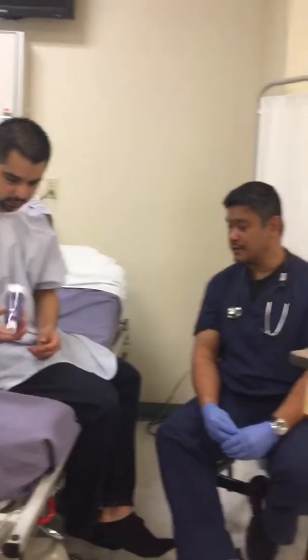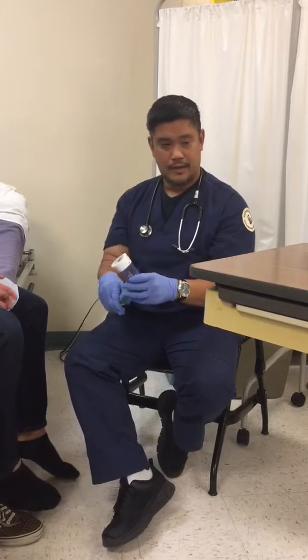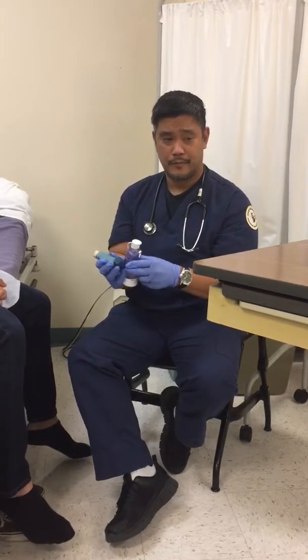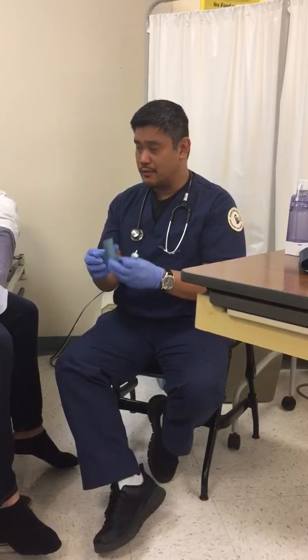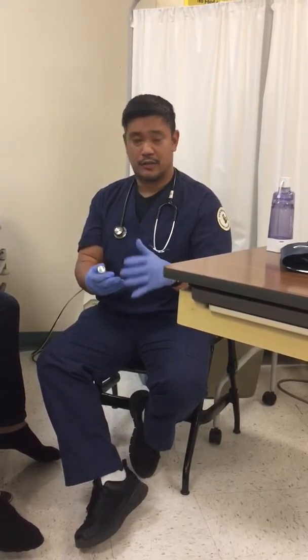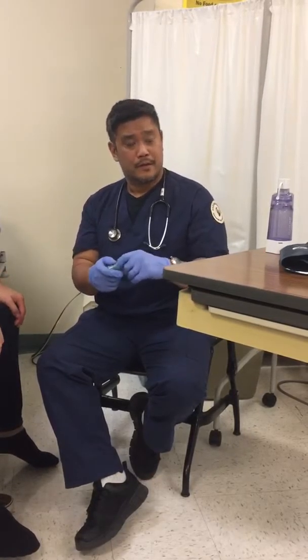And you will be taking this home with you when you get discharged. We'll be holding on to the medication until then. For cleaning purposes, if you do need to clean it, you just use some tap water, no soap or anything like that. So just remove the canister, run it under some water, and you're going to air dry this. You can do the same thing with the spacer. Again, no drying with a towel, just some water, and let it air dry.